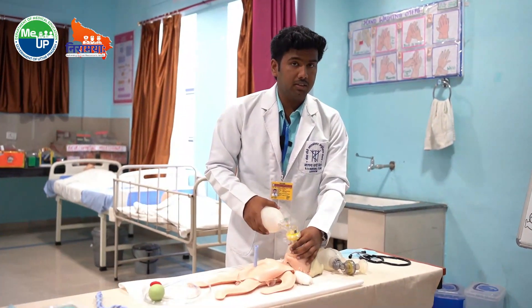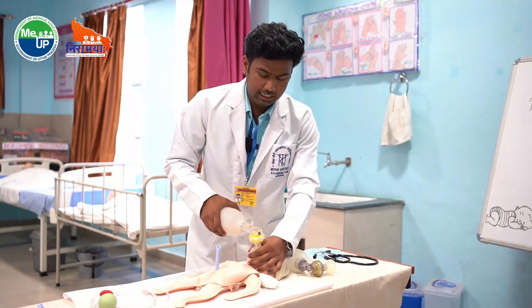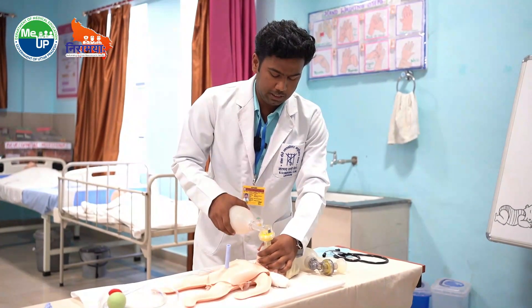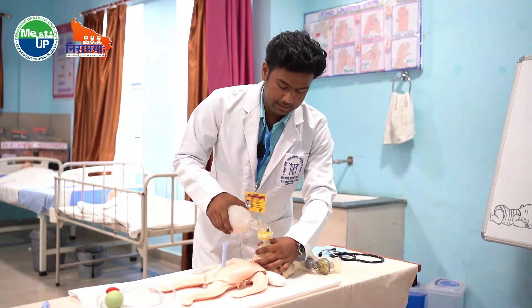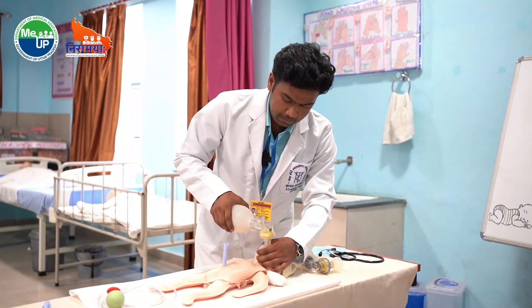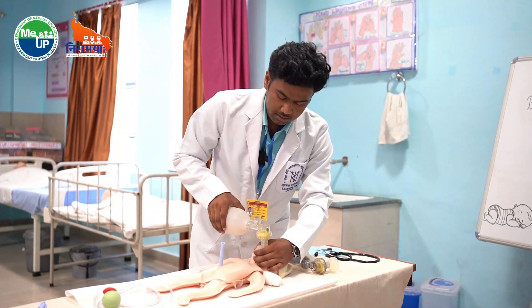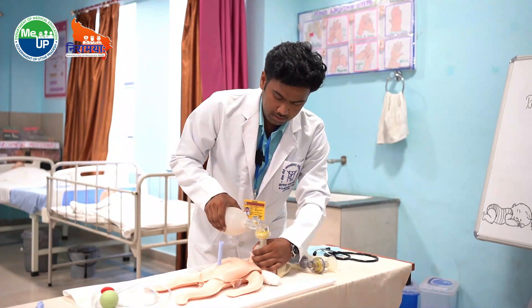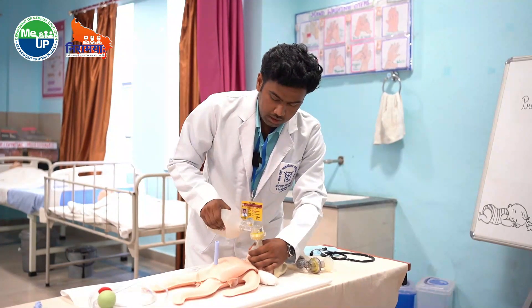Then we will start giving positive pressure ventilation. We will initially give 5 positive pressure ventilations, each prolonged for 2 to 3 seconds. The technique is: 1, 2, squeeze — 1, 2, squeeze — 1, 2, squeeze — and so on for 5 breaths.